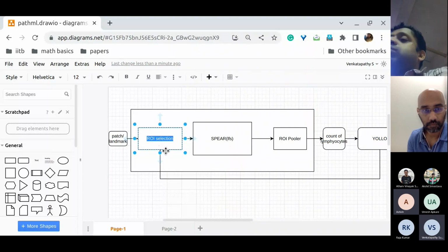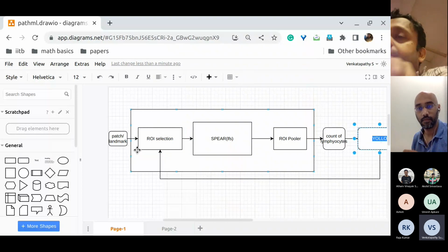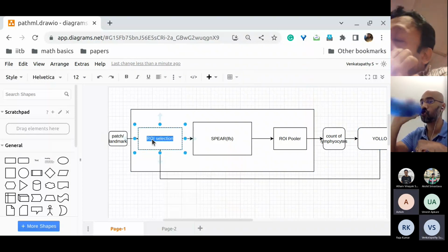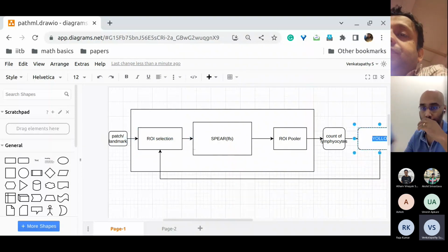Yes. Then we will also have an end model, a deep learning model, that will also be trained to detect the same ROI. What we will do is try to align these heuristics and the end model based on some loss function on intersection over union, because that is one of the standard ones, or any other loss functions.